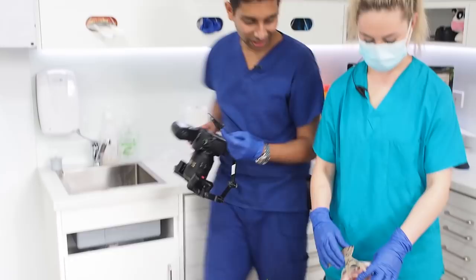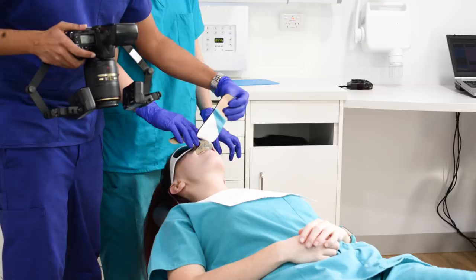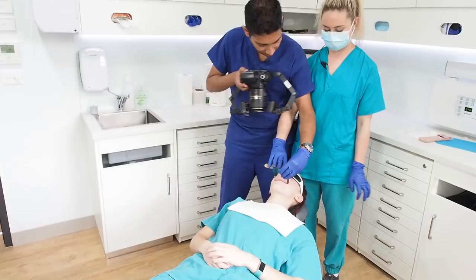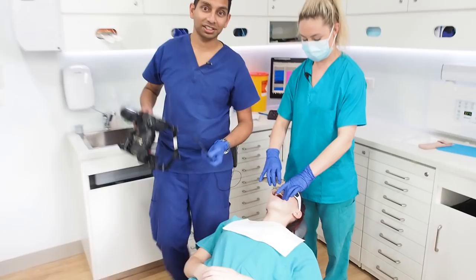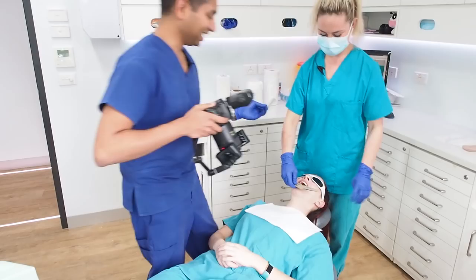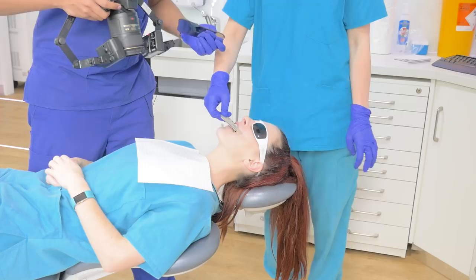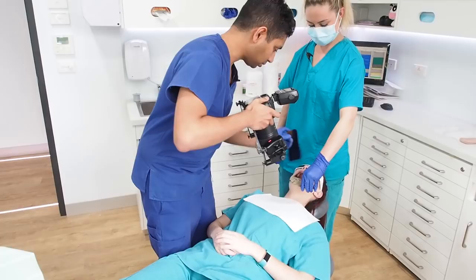Emma's going to retract the upper lip with a lip retractor. I'm going to pop the mirror in, leaning on Emma's hip just a little bit to give me that third point of stabilisation — obviously you check with the nurse that's okay first. You can get the patient to put their tongue up to the very top of their mouth and then just relax it.